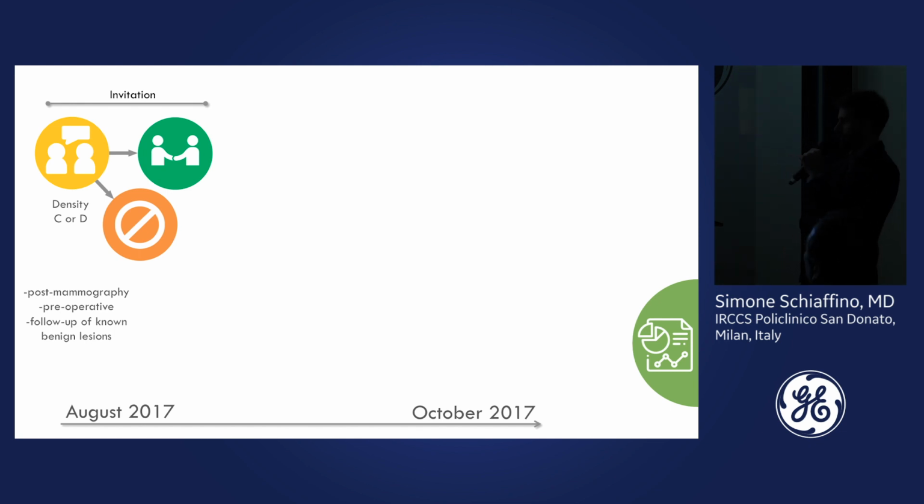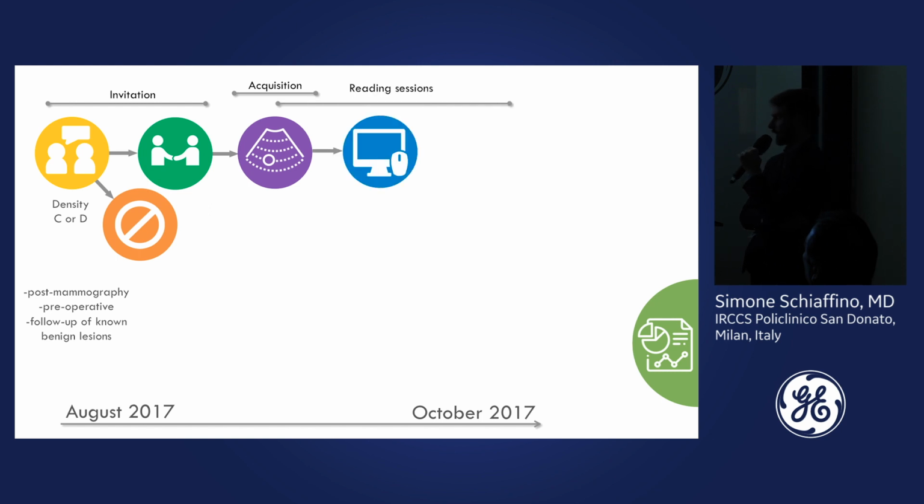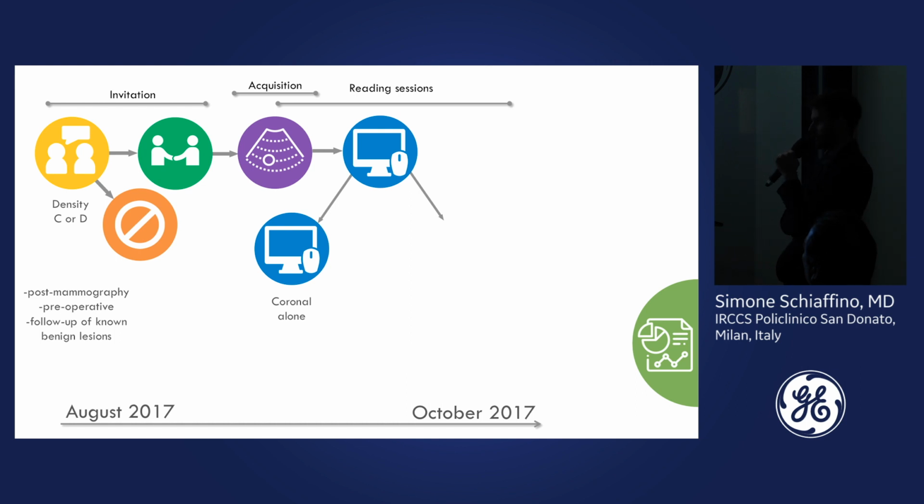And 2 different reading sessions were performed after. In the first one, the reader could only assess the coronal view alone, and in the second one, at least 1 month after the first, the reader could assess all the multiplanar views available.